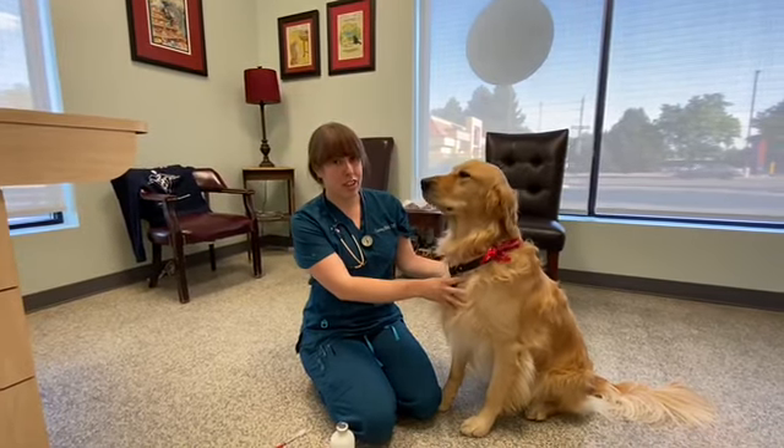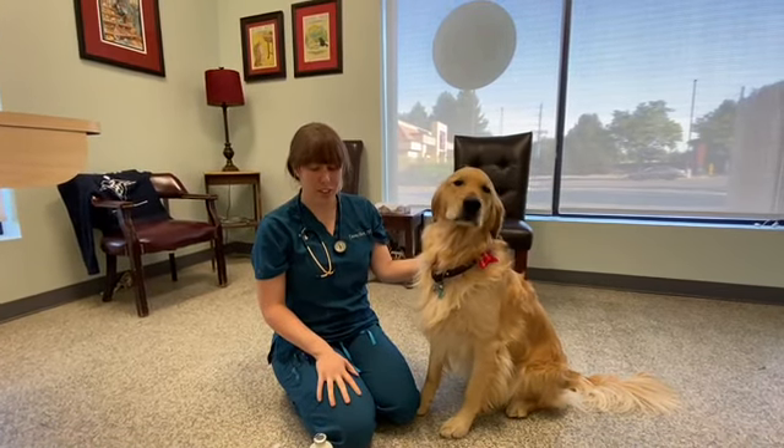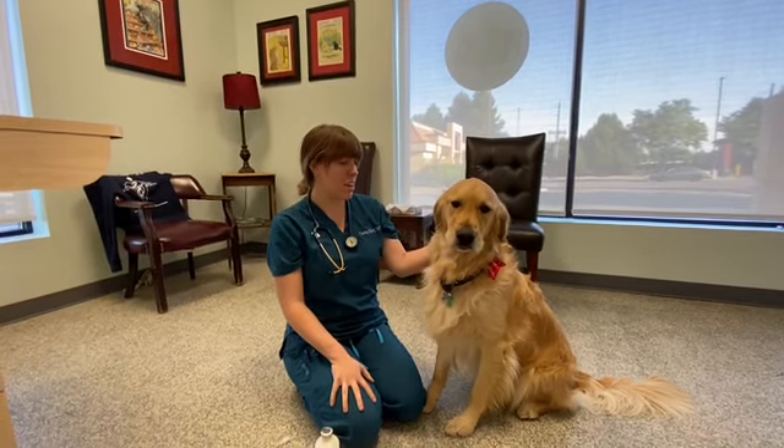Hi, my name is Casey. I'm with Animal Urgent Care. Today I'm going to show you a couple of things. The first thing I'm going to show you is how to give insulin to your pet. The process is the same for dogs and cats.